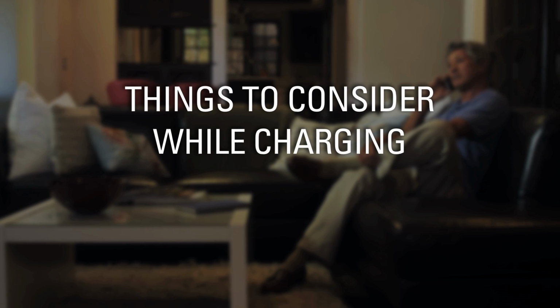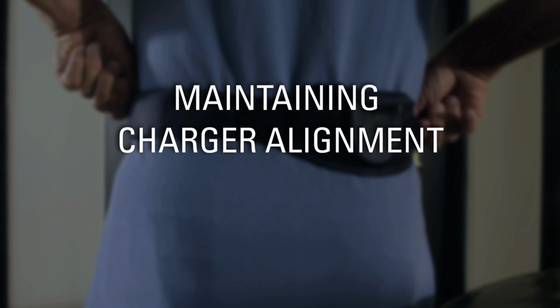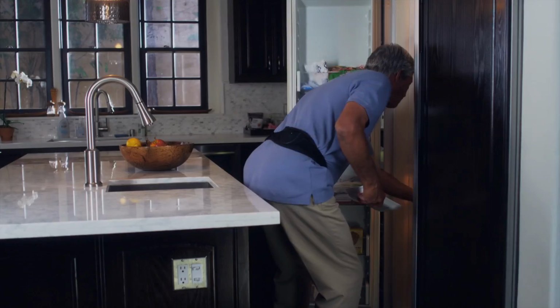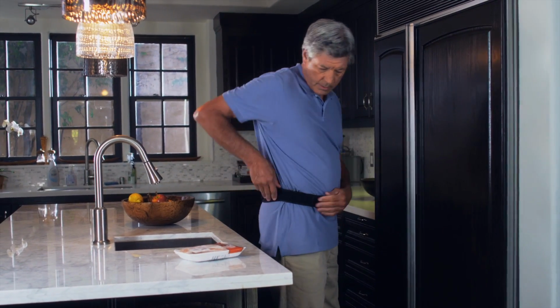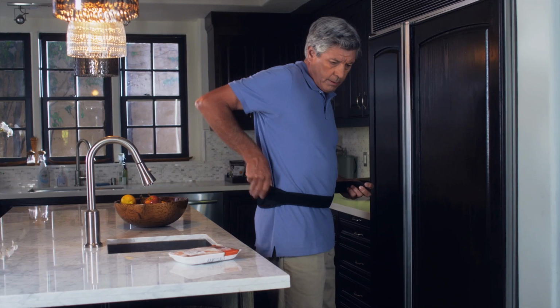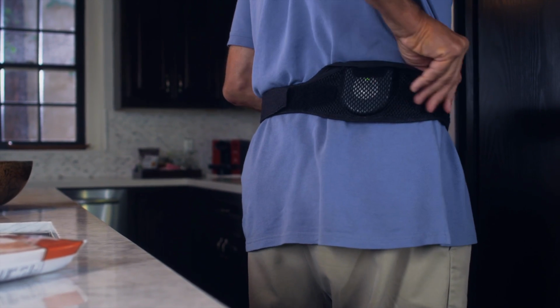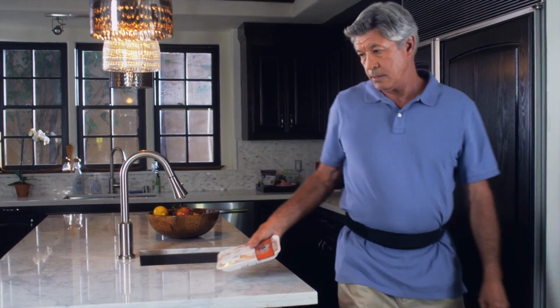Things to consider while charging. Maintaining charger alignment. If you hear the charger beeping a single beep tone, the charger belt has slipped out of alignment. If that happens, simply readjust the belt so that the charger moves back into the right position.